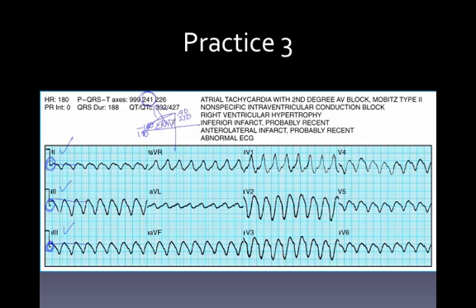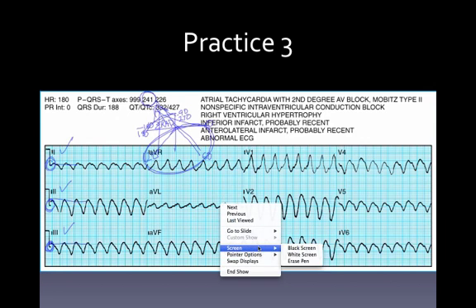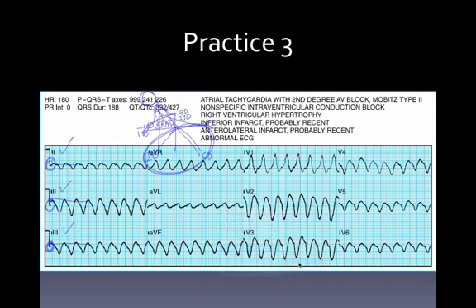From the other leads' perspective, lead 2, lead 1, and lead 3, 60, 0, and 120, it looks like all of the energy is headed away from it. So this probably started somewhere in the ventricles. It should just increase your suspicion. Now, I left one more thing up here.